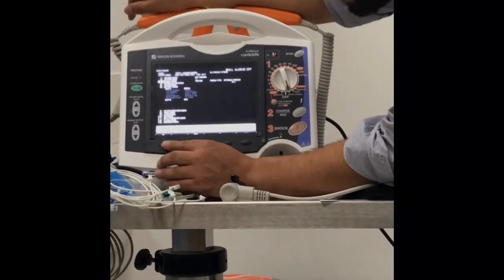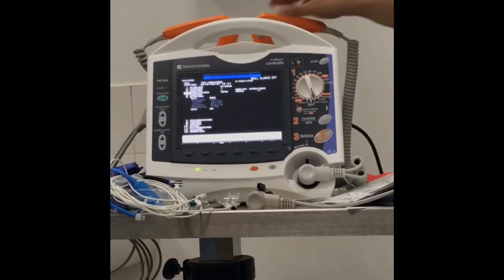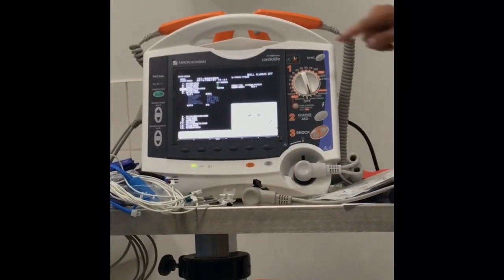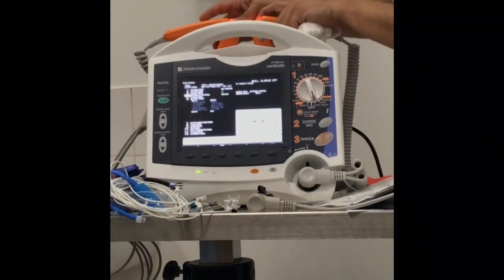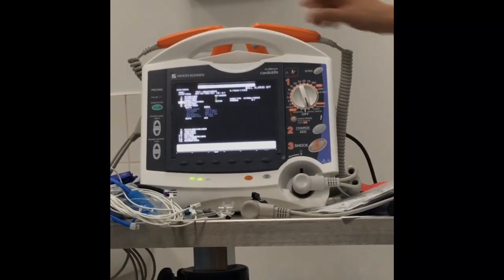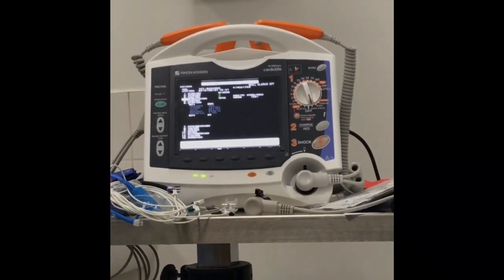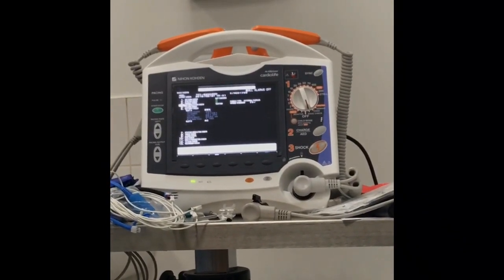Now we go to the max. The first one goes to 60 joules, the second charge will go to the max. Then the machine will discharge automatically, no need to press anything. Now press the start stop key. I have to press the start stop key here to check the pacing function.